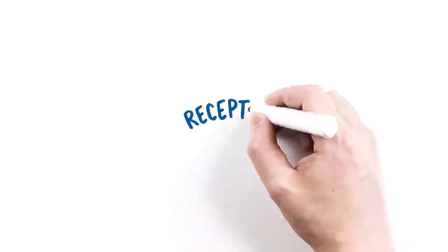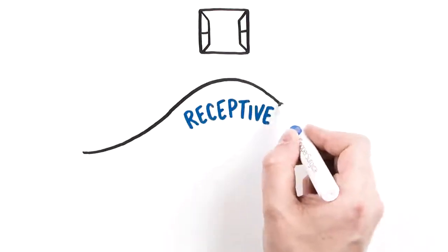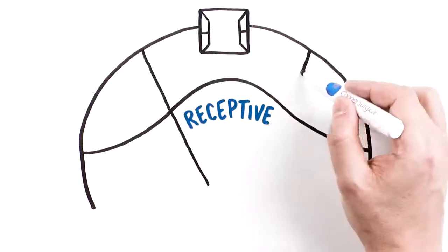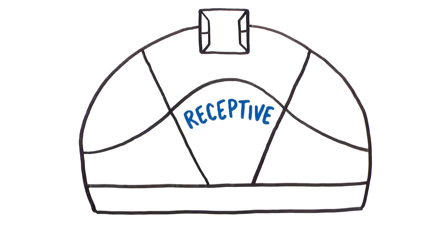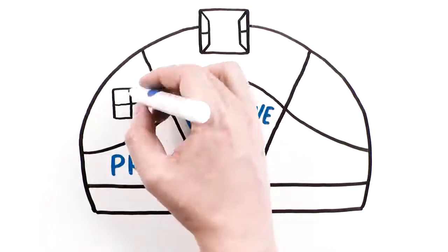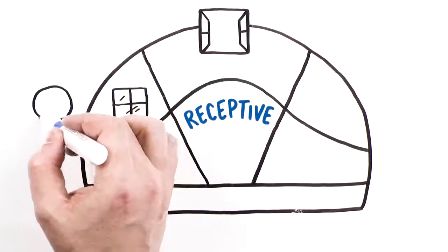A receptive test result means the patient's window of implantation is within the expected time frame and her endometrium is in the receptive stage. In such cases, embryo transfer is recommended at the same time as when the endometrial biopsy was taken. A pre-receptive test result means the patient may have a displaced window of implantation and her endometrium is not receptive yet to the embryo.